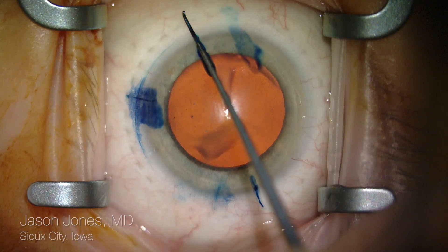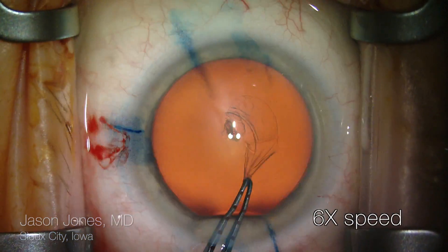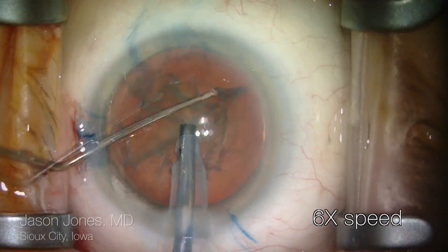This provides final orientation of the lens implant. This is going to be a toric extended range of vision lens.